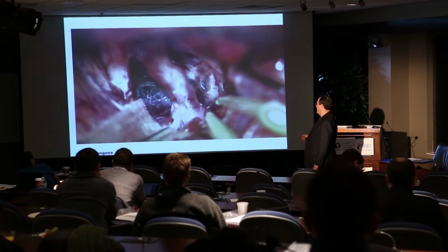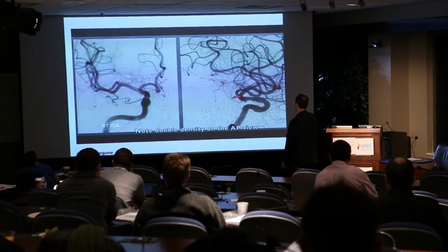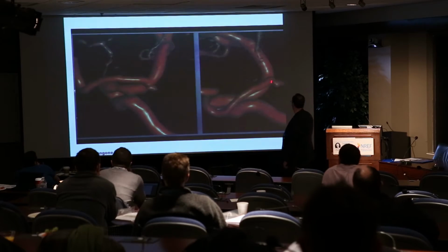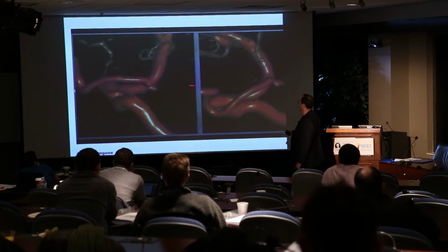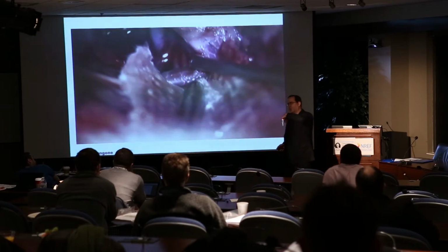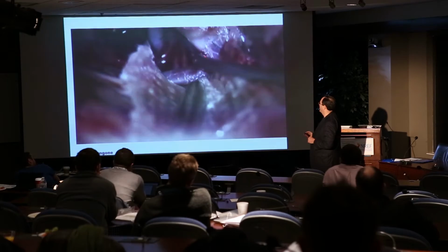So this is a patient that actually had an A1 aneurysm. These are tiny aneurysms, see them here, that are notorious for rupturing at a very, very small size. You see how irregular they look? They're hiding directly on the proximal portion of the A1 and they point directly out of your line of vision. And it's very hard to see them.